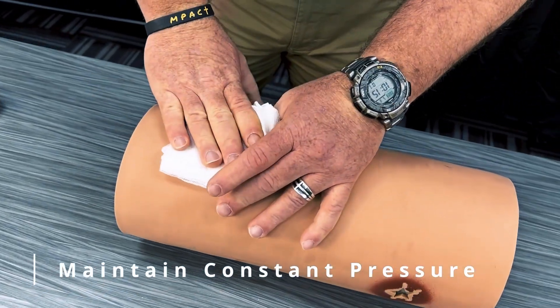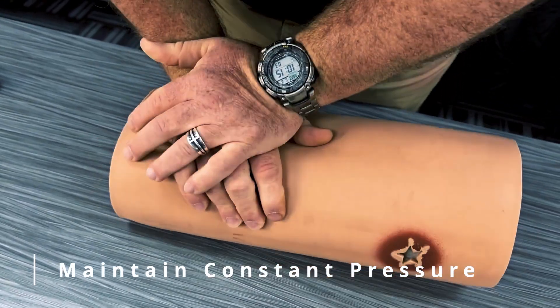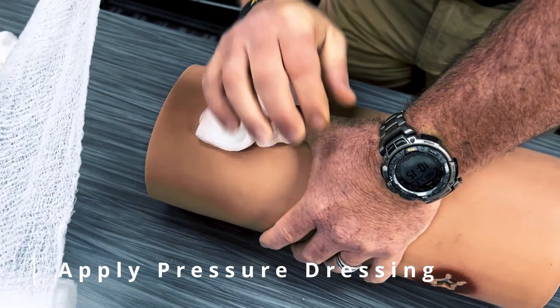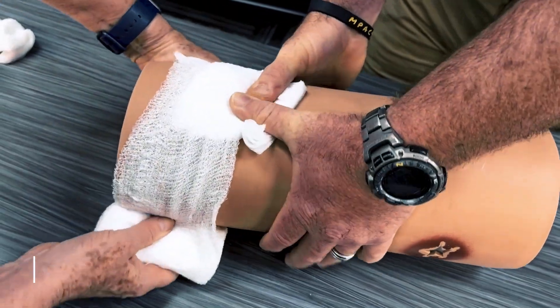Apply constant pressure over your packed wound cavity for at least three minutes to allow the hemostatic agent to activate. Apply a pressure dressing over the wound to maintain consistent pressure on the bleeding source.